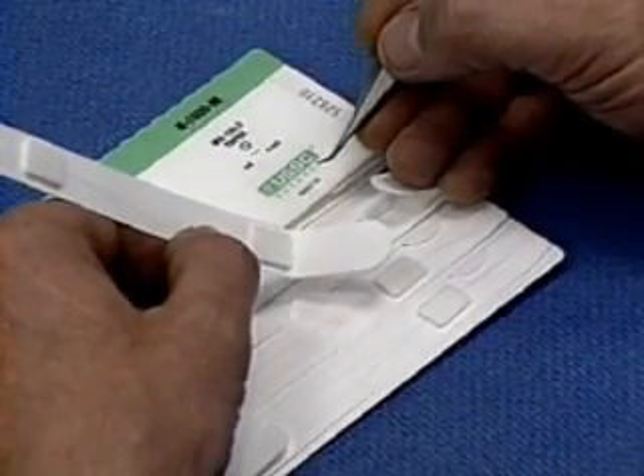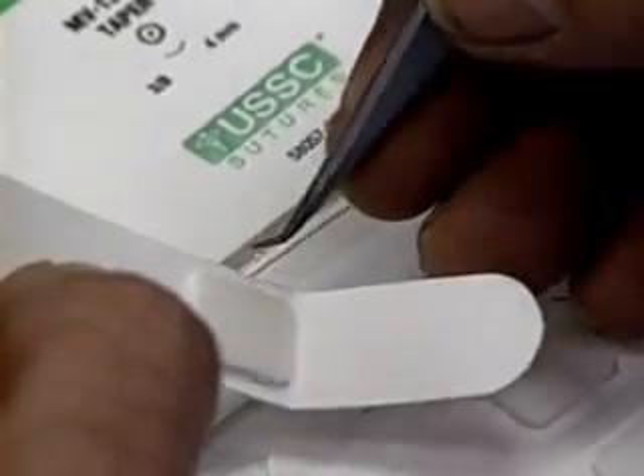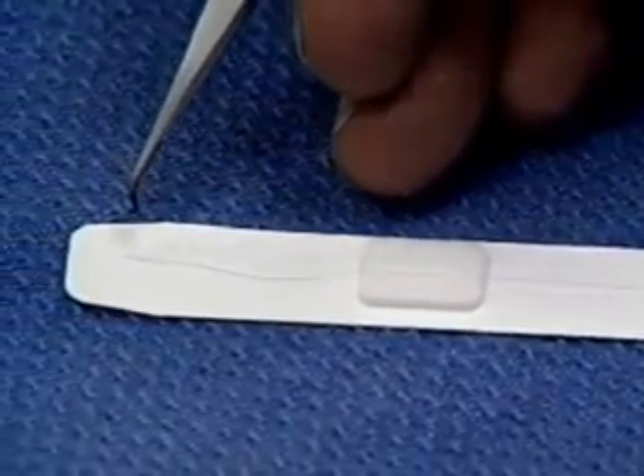We use a clinical grade suture material packaged for laboratory use — it's 10-0 nylon on a sturdy 140 micron needle. Twelve centimeters of thread is all you need; if there's more, cut it off.